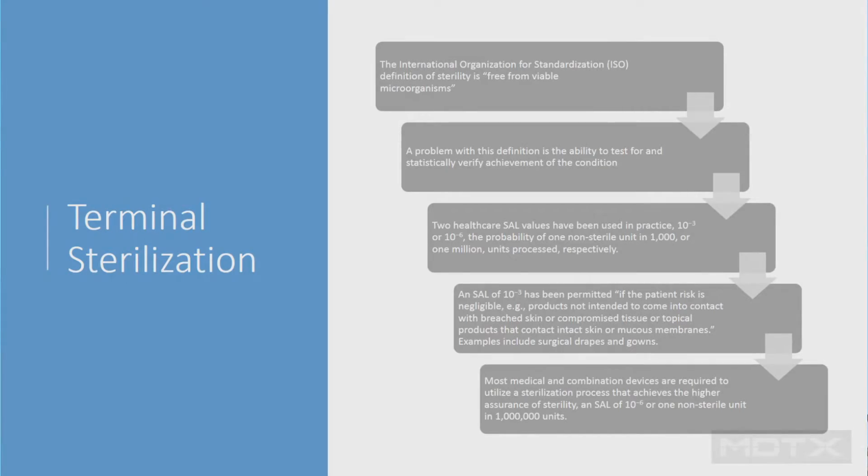So basically, terminal sterilization is defined by ISO: the definition of sterility is free from viable microorganisms. The problem with this definition is how to test and statistically verify the achievement of the condition.